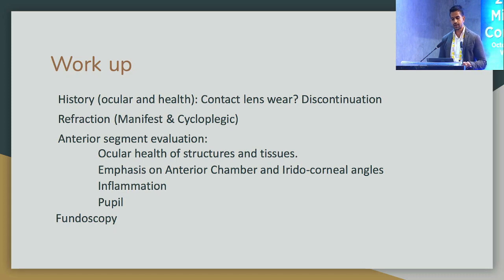Look for the pupil size. Don't just do the anterior segment evaluation and send it to the retina consultant. At least in the initial stages, see your patient back. Make sure the pupil is well dilated, because with a mid-dilated pupil, you might have difficulty in tucking in the haptics initially. Do a thorough peripheral fundus examination where if there's any peripheral lesions, make sure that barrage laser or treatment is done at least 2 weeks prior to your ICL surgery.